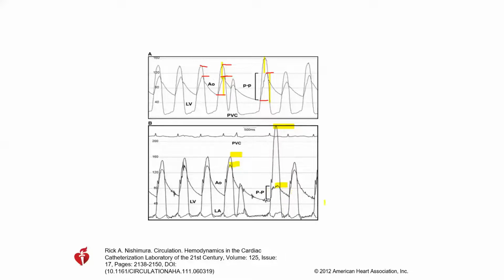Okay. So, what is the difference between fixed aortic stenosis and HOCM as to this kind of tracing? In both, there will be an increase in gradient. In both, increase here, increase here. So this increase is not a distinguishing feature. So don't say it increases more in HOCM, no. The increase is in both conditions. So this is not a distinguishing feature.